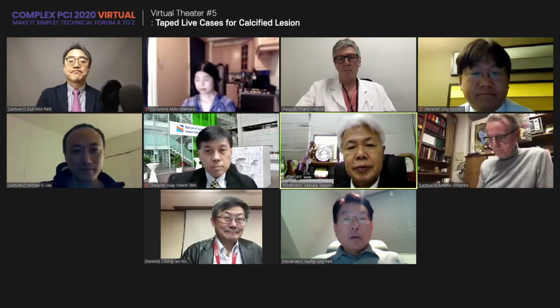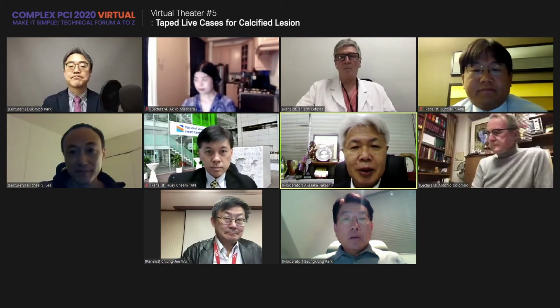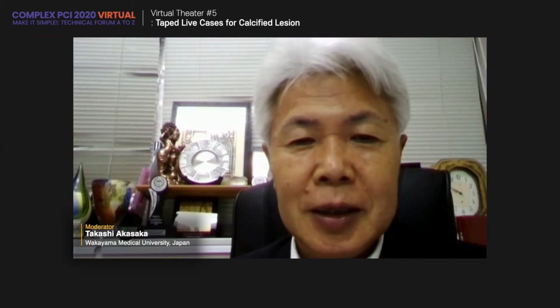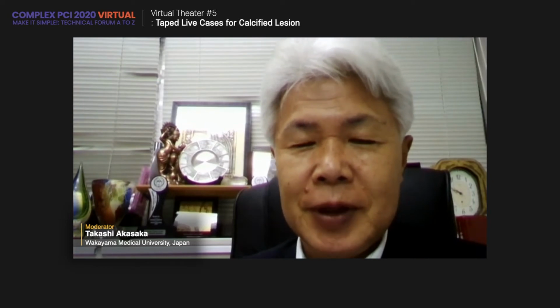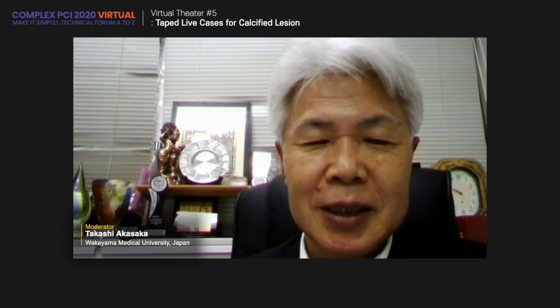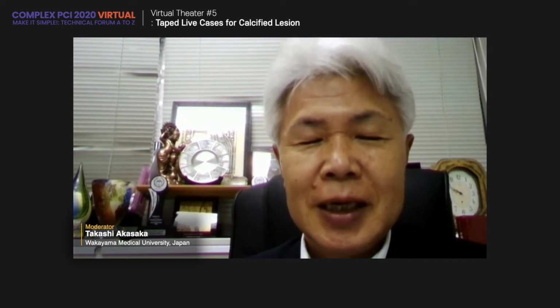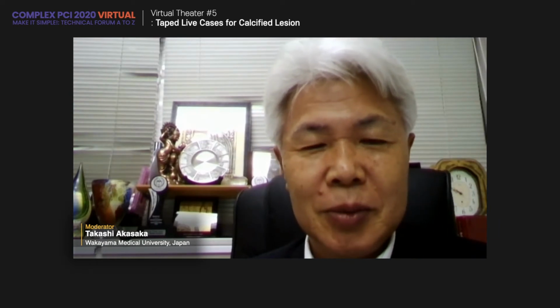Okay, Dr. Lee, I would like to ask about the timing of orbital atherectomy, right? If the calcium is on the myocardial side in the LAD during pullback, we can use orbital atherectomy very well.